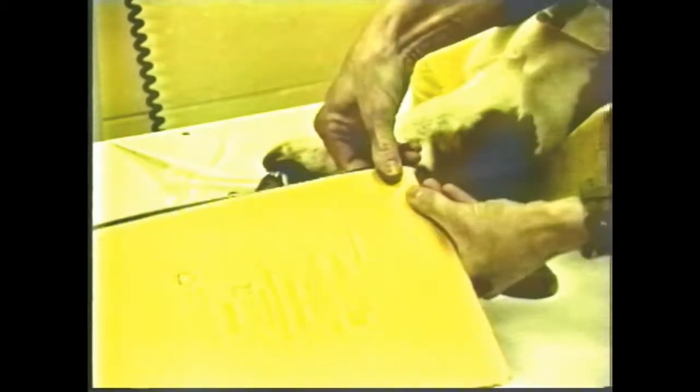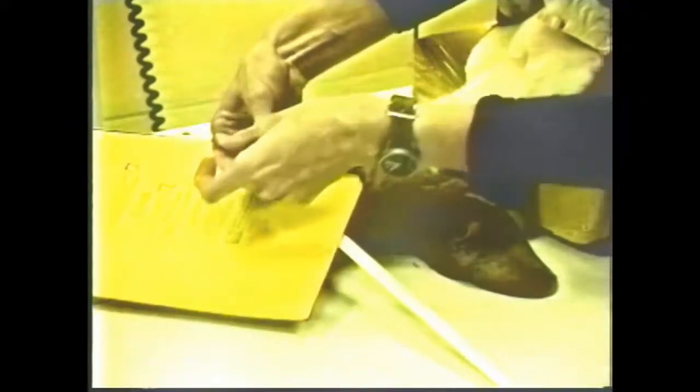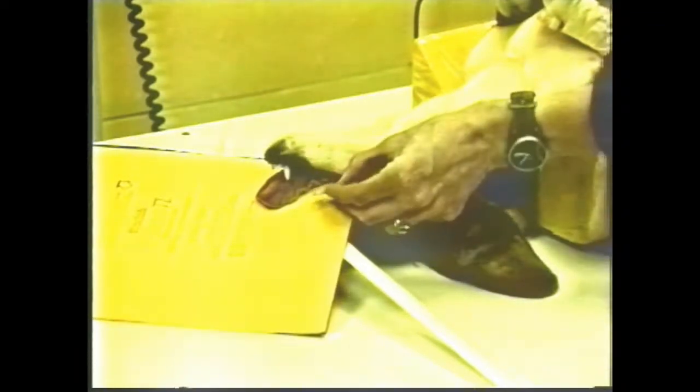Non-screen film is also packaged in larger, more easily obtained units. The exposure is approximately the same for this type of film as the dental film. It is somewhat larger and may be easier to process under some conditions than dental film.